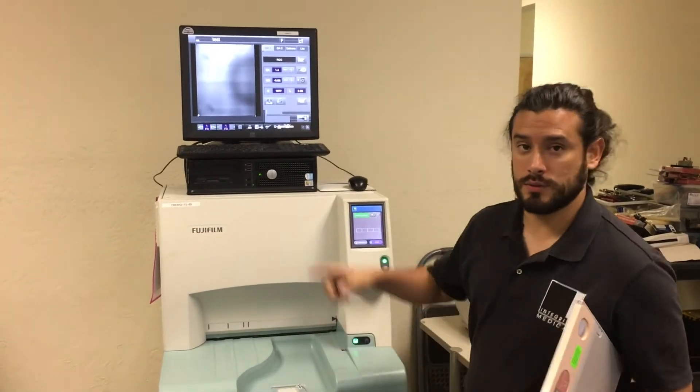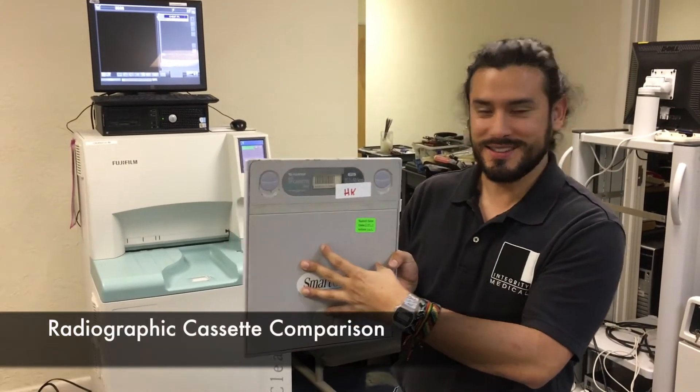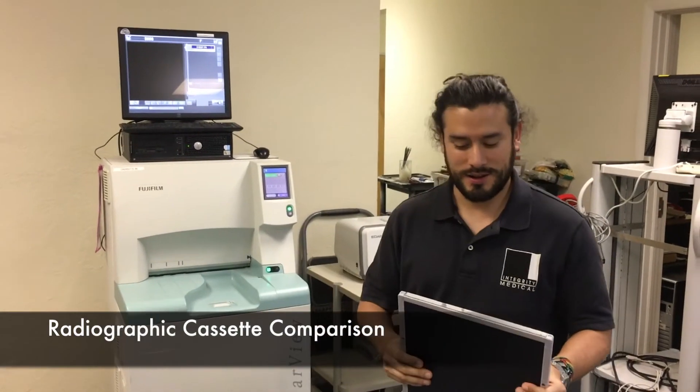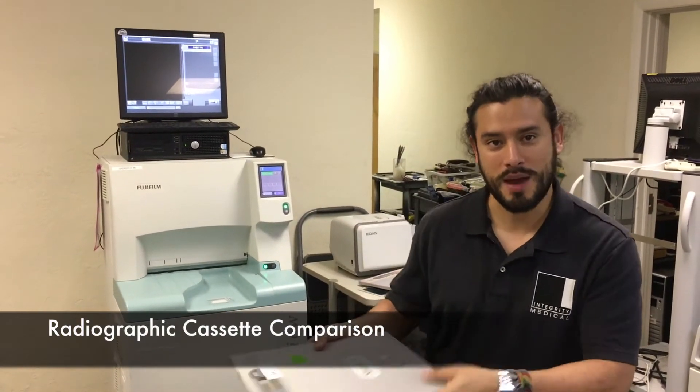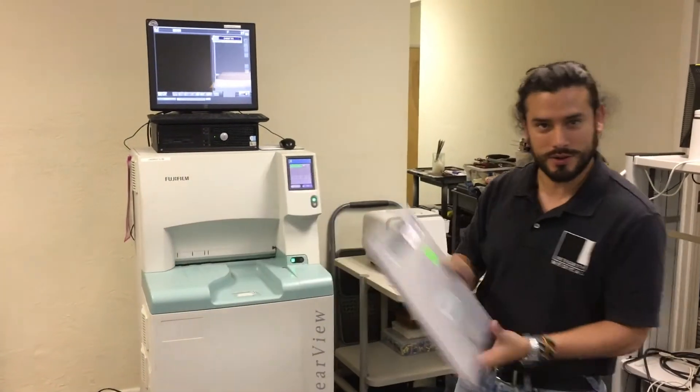Now we're going to do the radiographic view. We're going to use a radiographic cassette, same unit. You can see the difference — it will take mammo, you just saw that, and now you will see how you can use a radiographic cassette.